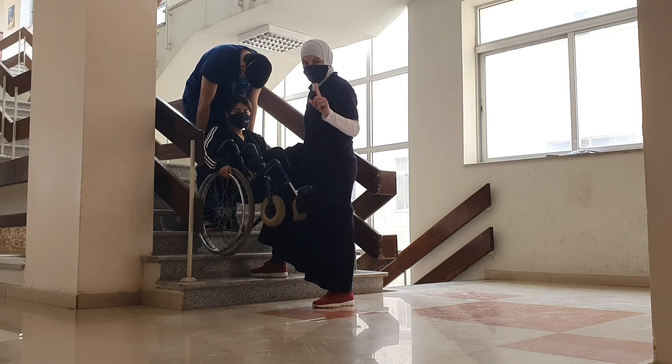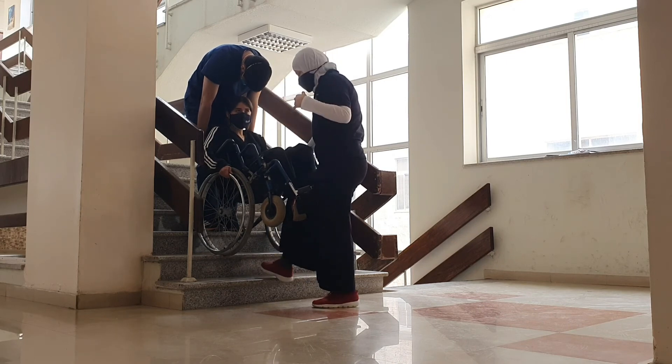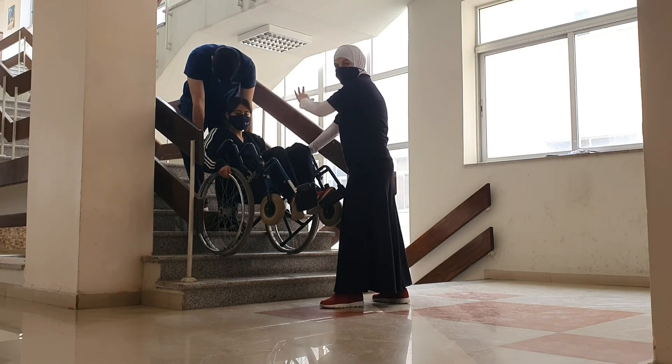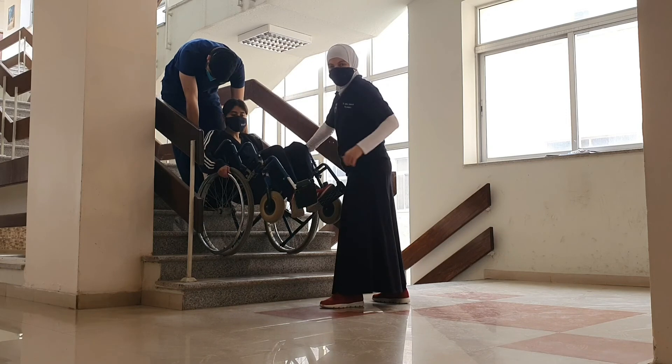If it were one person assisting, then that one person would be from behind. If it were four people, then two would be in front — one on the right and one on the left — and two people behind, with one person holding each push handle.